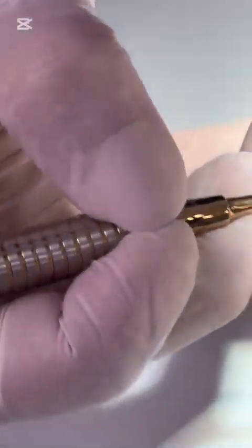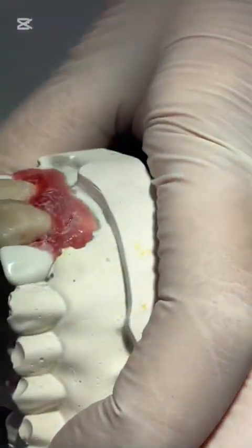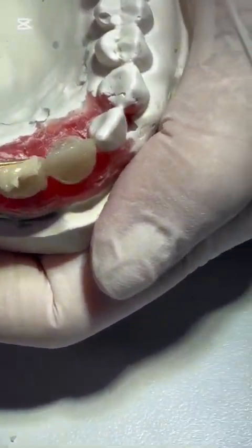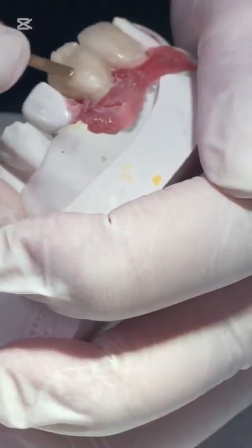Okay, now I'm lengthening this one too. I will increase the length of this one. And then you will do adjustment, the same length, same width for both teeth. Okay?